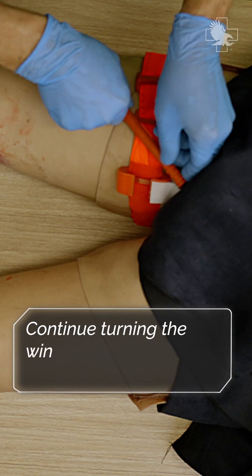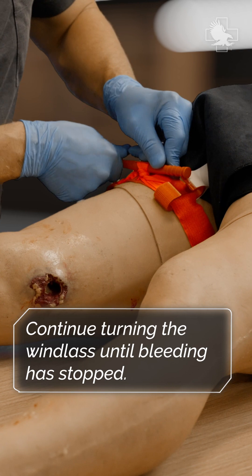Now I'm going to start tightening the tourniquet. The first thing I'm going to look for is: did bleeding stop? I've got no bleeding, so now I know I've got it on tight enough.